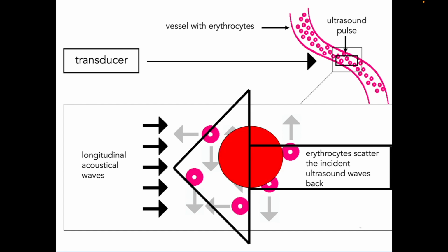If an embolus is entering the bloodstream for a short moment in time, the backscattered ultrasound energy is increased. The embolus is depicted here as a large red circle, the increased backscattered energy by the bold lines of the open arrow.